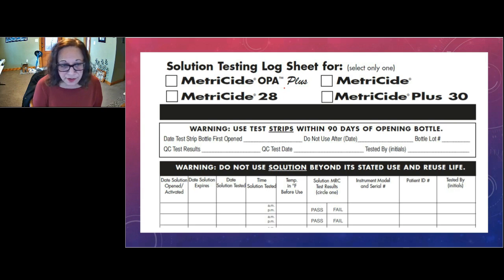And then, of course, the tested by, who actually did it, the initials of the person who actually did the soaking. Sorry, my head was faster than my mouth there.